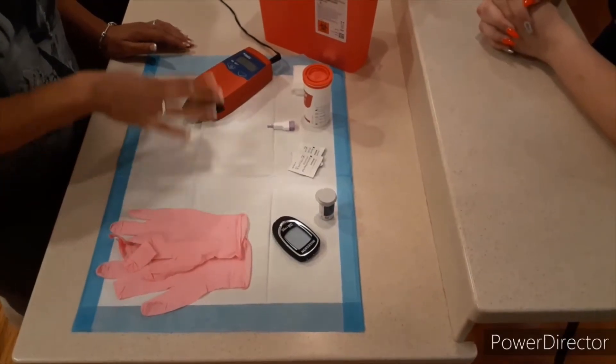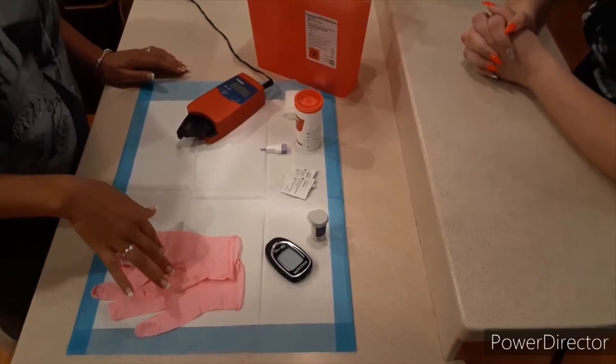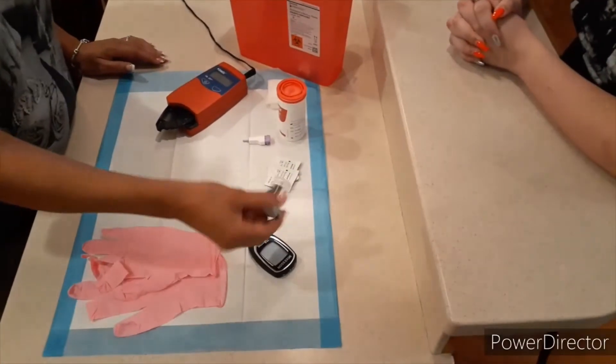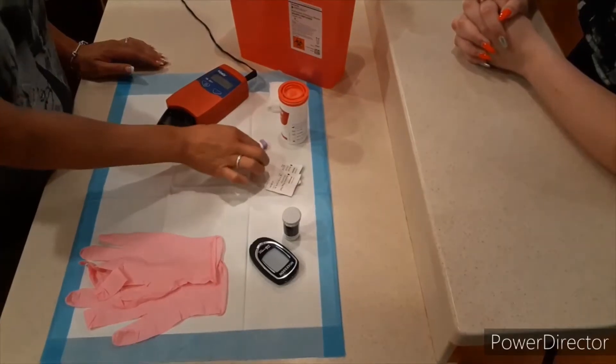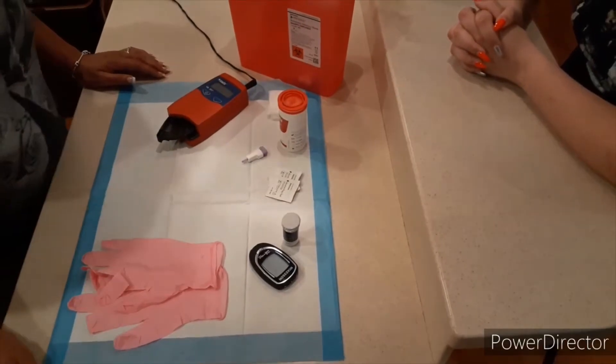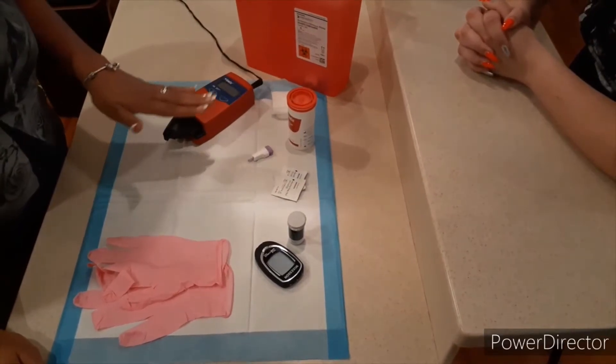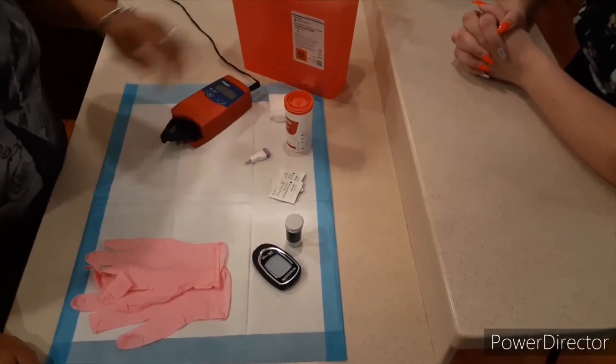We have all of our equipment together. We have our gloves, our glucose machine, our glucometer, our testing strips, alcohol lancet, our hemocube, microcuvettes, and a 2x2 gauze, as well as our hemocube machine and sharps container.